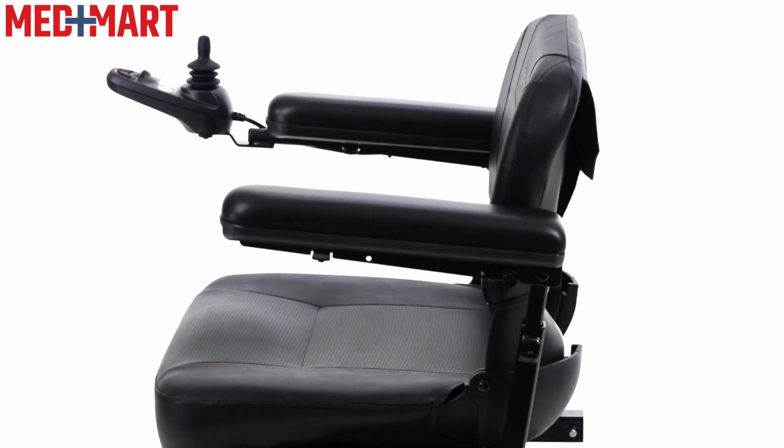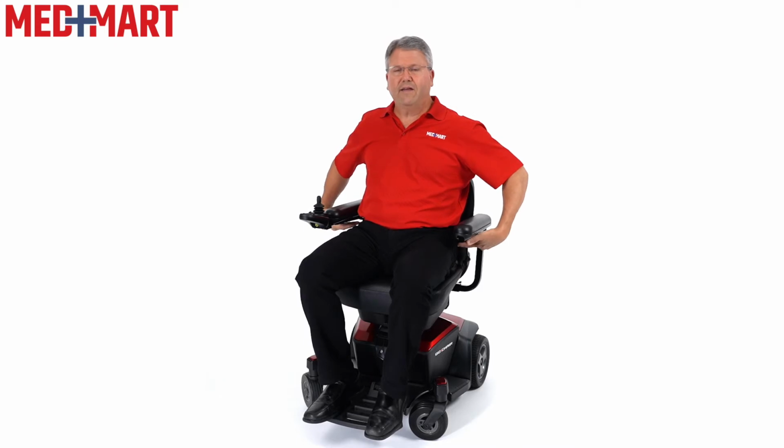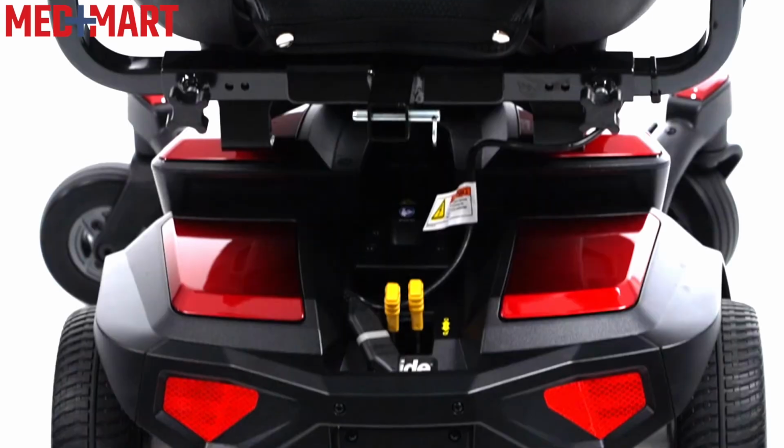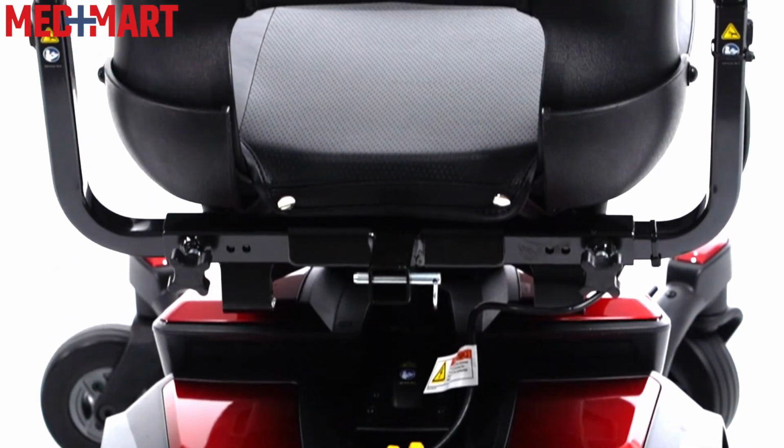I can customize a few things though from here. This arm will come out about 2 or 3 inches forward. I can bring the joystick forward to make my arms more comfortable. I have the option of also elevating the arm height and tilting them at a little bit of an angle to make it more adjustable for myself. Also, I can widen the arms themselves if I need a little more width to relax my arms. So you do have several ways of adjusting this and customizing it to you.